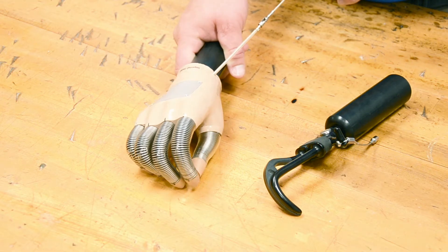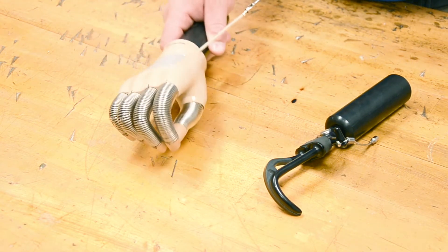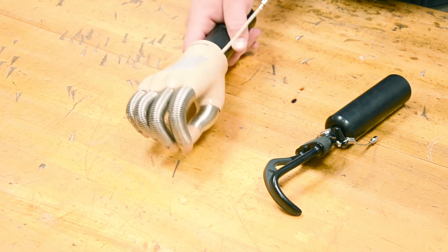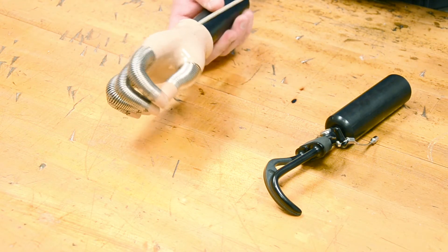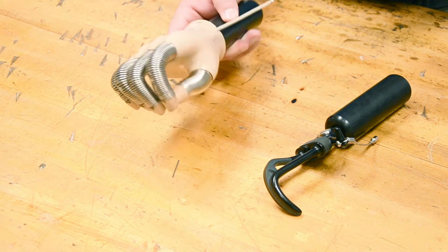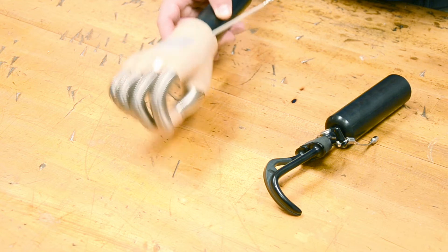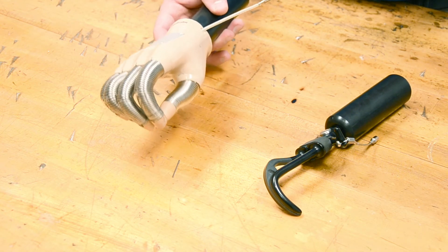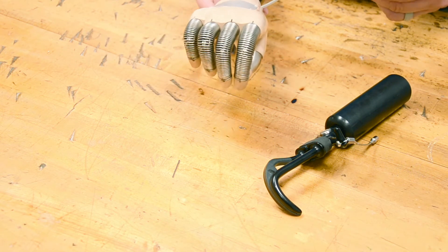Another problem is I can't see through the mechanical hand — I don't even know if I have hold of an object until I flip it around to check. So I can't tell whether I'm picking it up or not. With a mechanical hand, the real challenges are: I can't see through it, it's heavy, it's not very efficient, and I have no fine pinch at the tip. It's good for cosmetic appearance, but not great for fine manipulation.